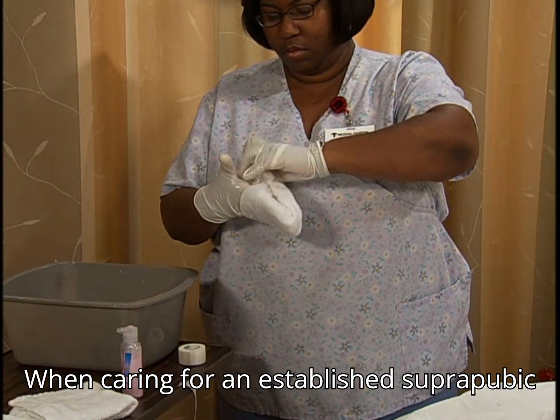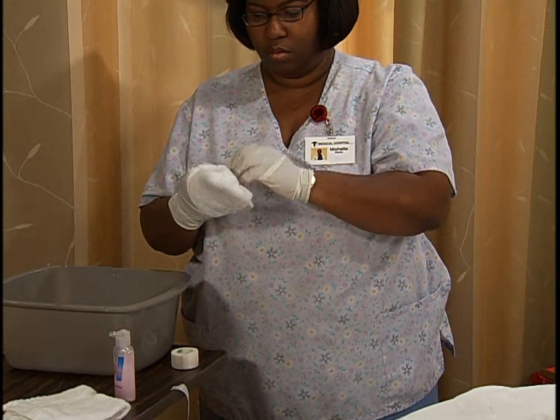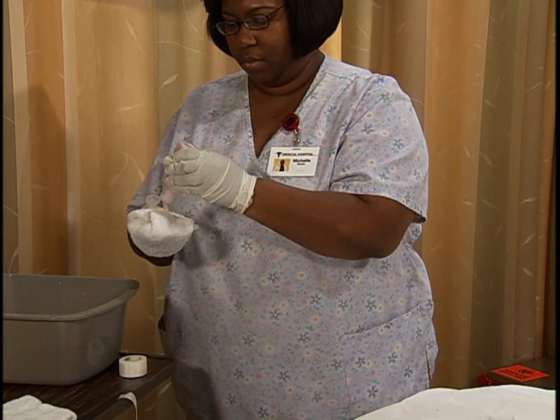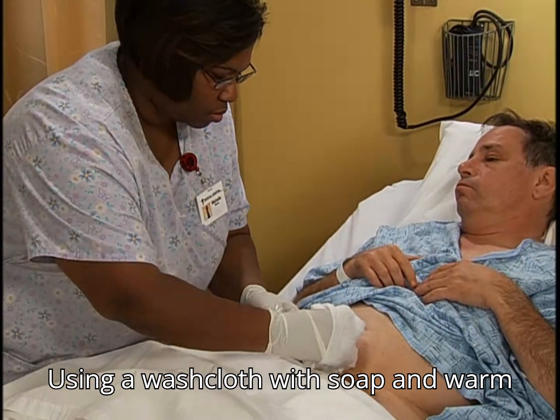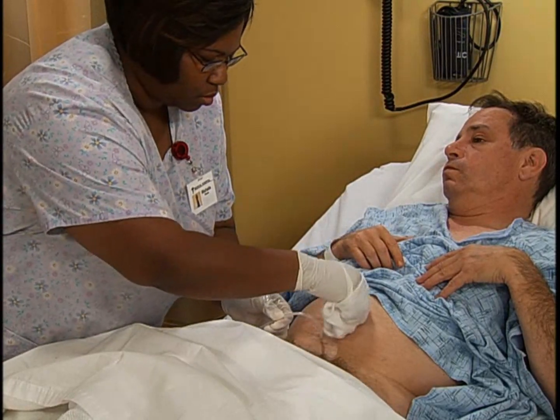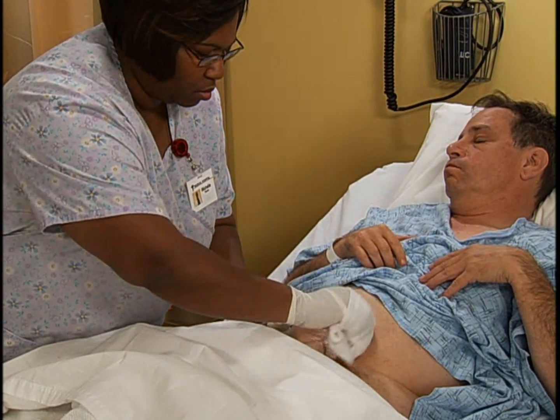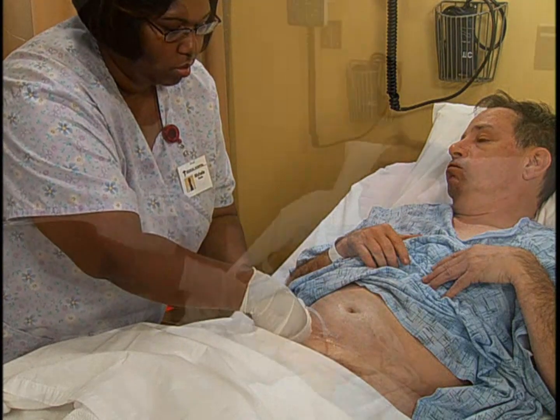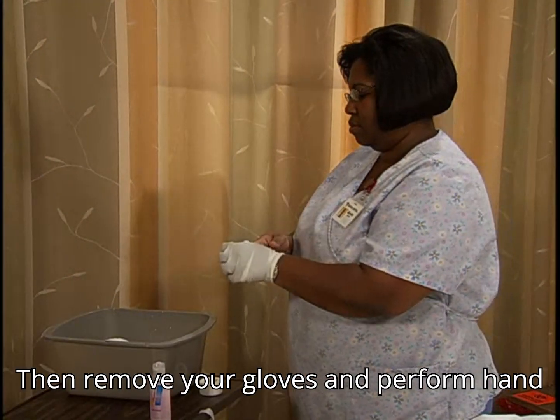When caring for an established suprapubic catheter, put on clean gloves. Using a washcloth with soap and warm water, gently clean in a circular motion from the exit site out. Rinse and dry the area well. Then remove your gloves and perform hand hygiene.